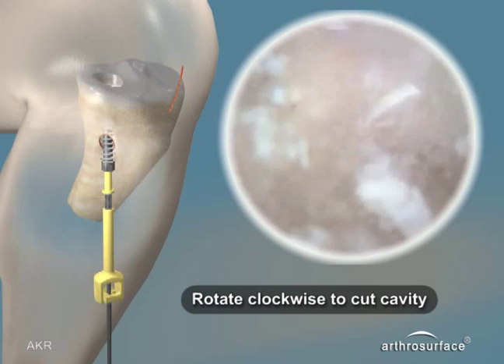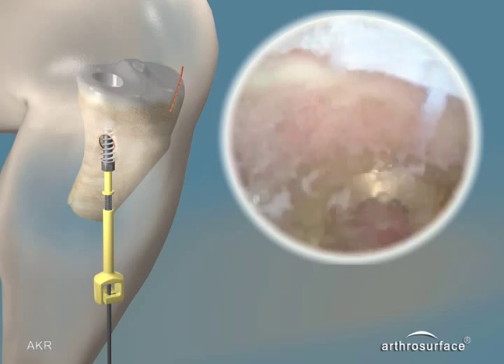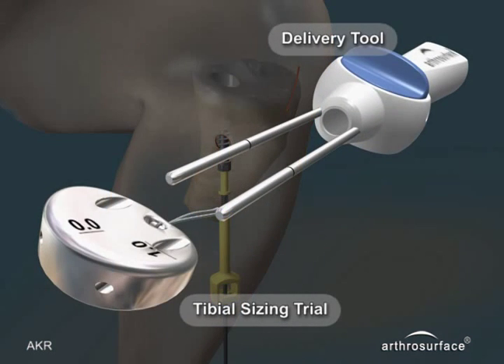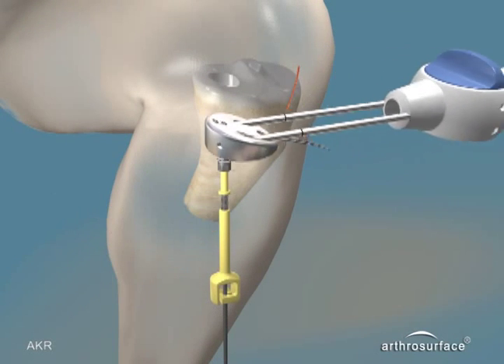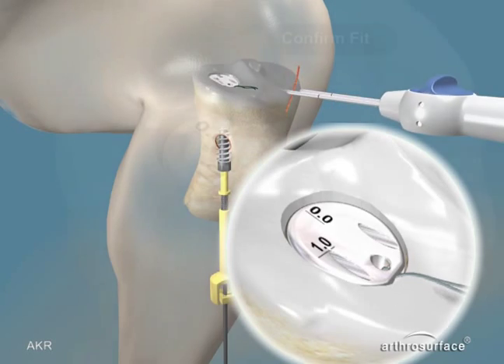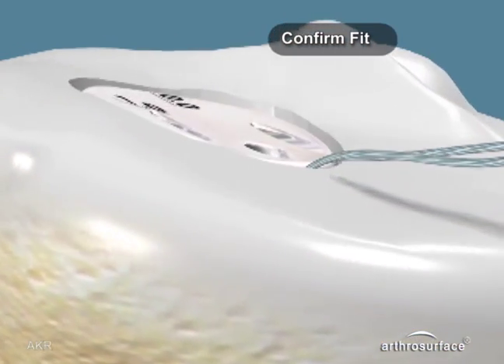Begin counterclockwise rotation of the blade to normalize it to the tibial plateau, then clockwise rotation will cut the cavity. Continue until the blade is stopped by the proximal end of the blade stop. Insert the tibial trial into the portal and place over the blade. Confirm the orientation of the tibial trial so that it is flush or slightly recessed medial to lateral and anterior to posterior.